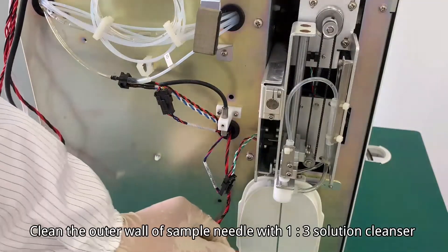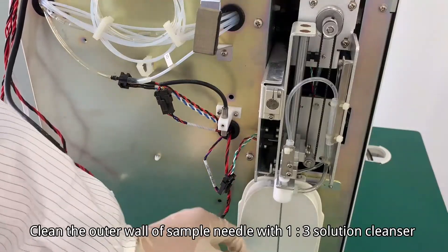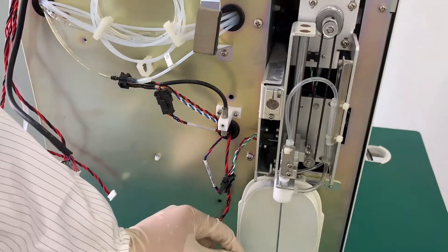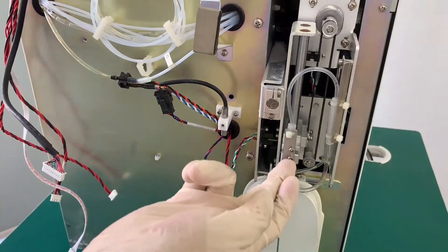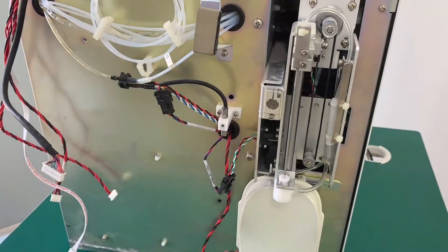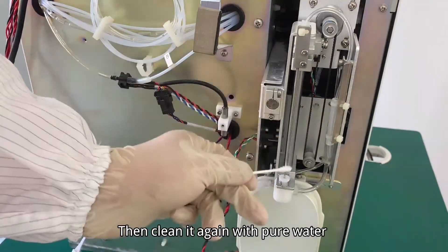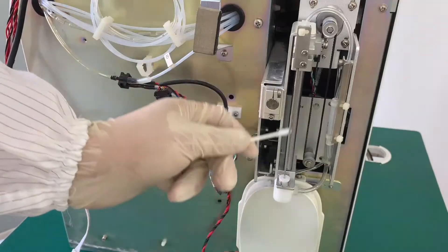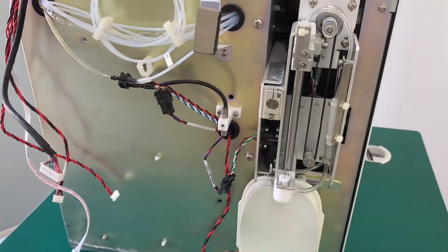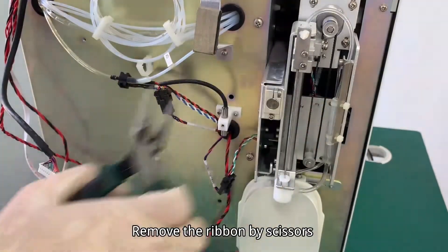Clean the outer wall of the sample needle with 1-2-3 solution cleanser. Then clean it again with pure water. Remove the ribbon by scissors.